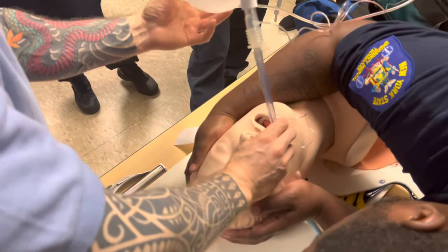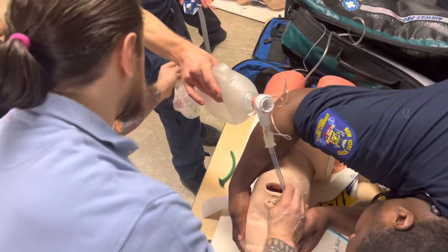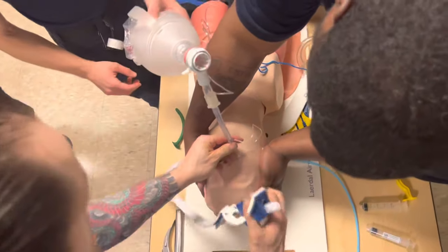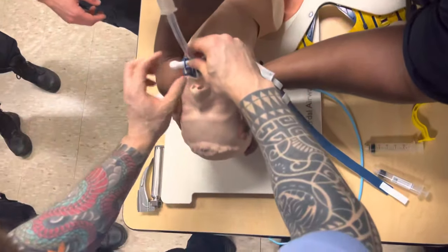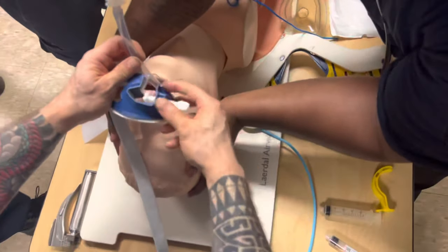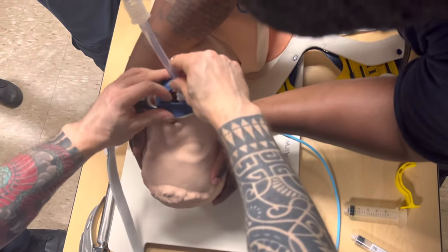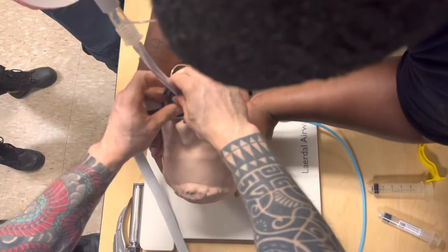Once we have established this, ventilate and I'm going to take the bi-block. One thing I see you guys doing is placing it like this - don't place it that way. If I want to suction, I want this opening to be towards the feet, because then I can put a Yankauer in if I need to open the mouth. So the bi-block opening faces toward the feet.